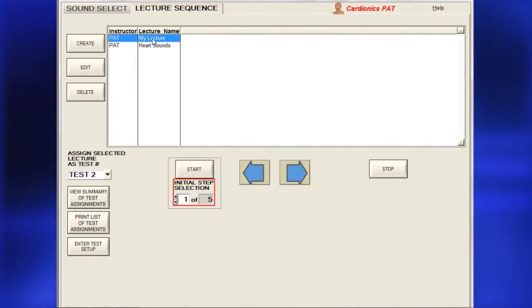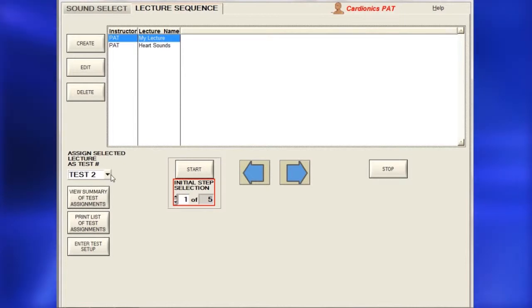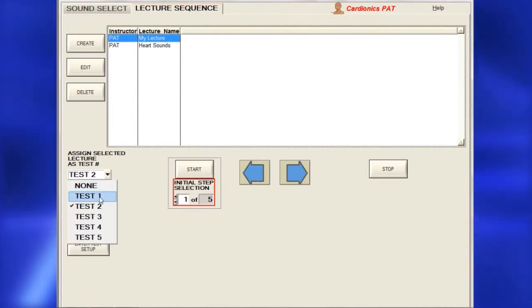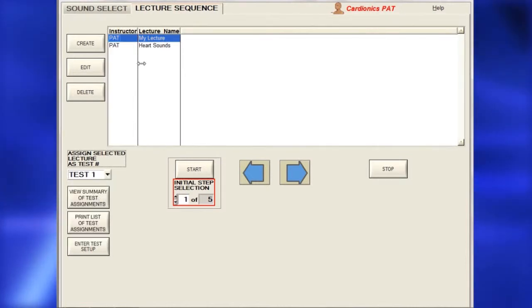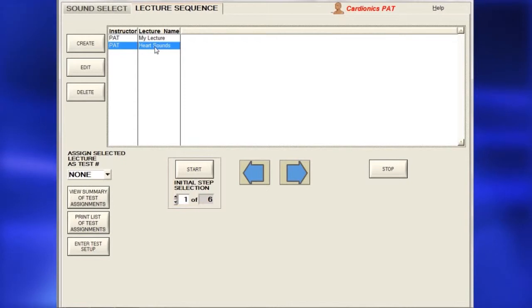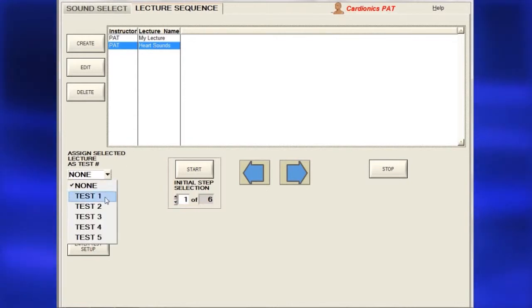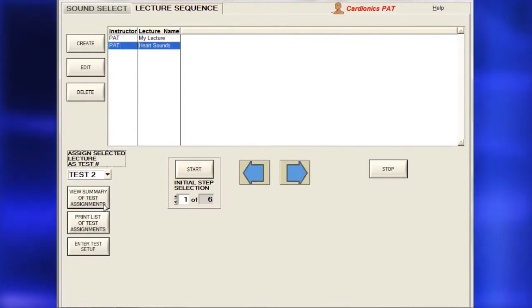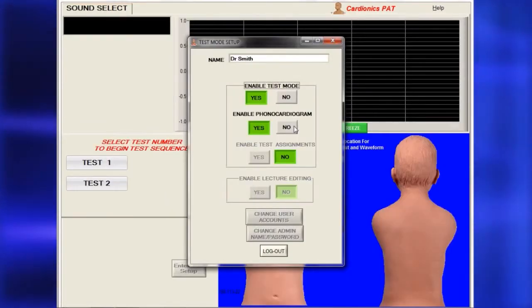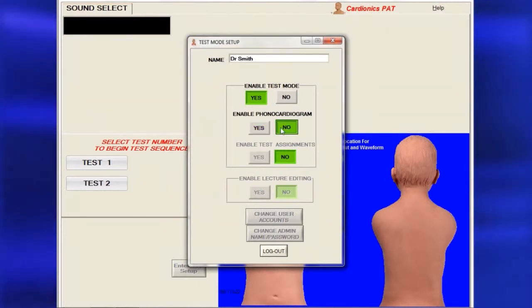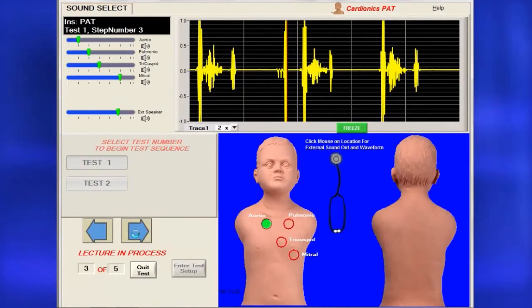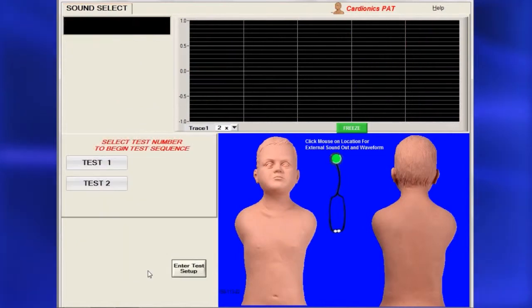If a lecture is to be used as a test, it must be assigned a test number. To create a test, select a lecture sequence, instructor, and test number, then click Start. Next, choose whether to display a phonocardiogram on the test. To quit the test at any time, click Quit Test.